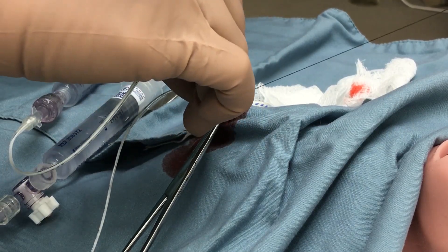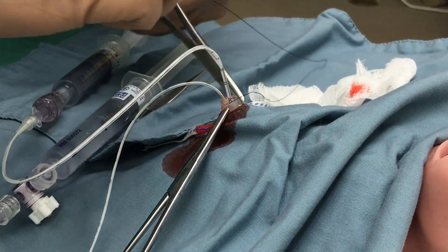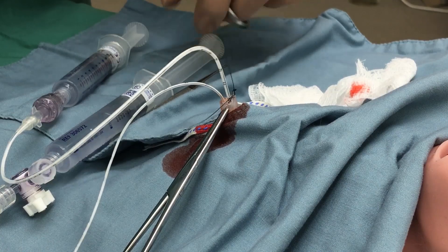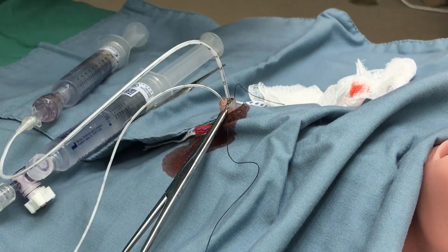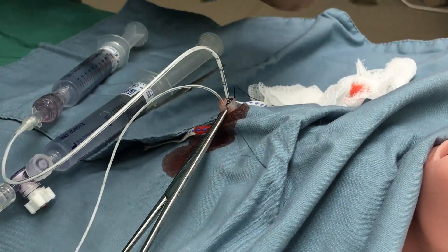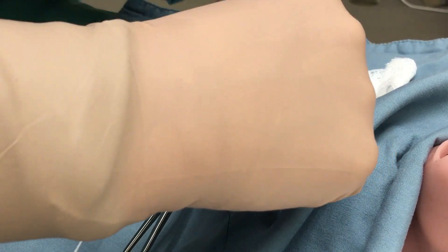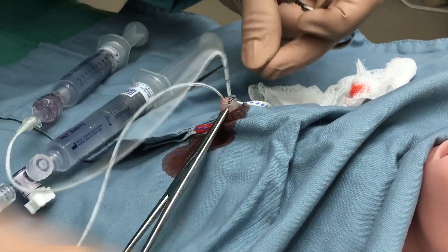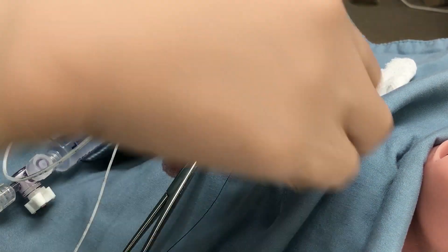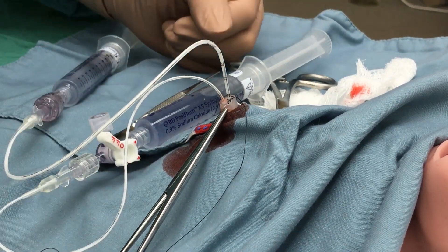All the way, ensuring that we're still at the right depth, and knotting it securely. It's nicely in place. You would proceed to do suturing of each vessel separately to the cord.